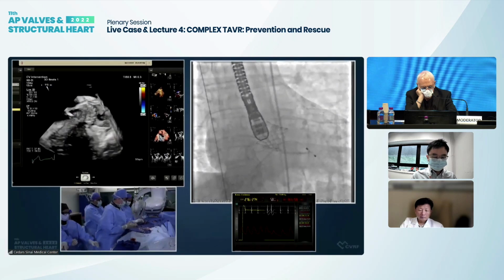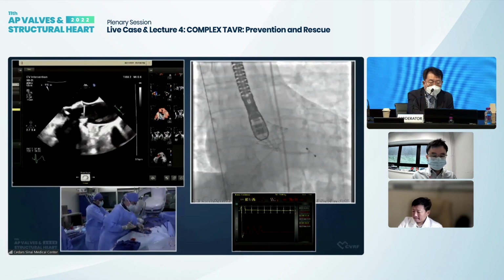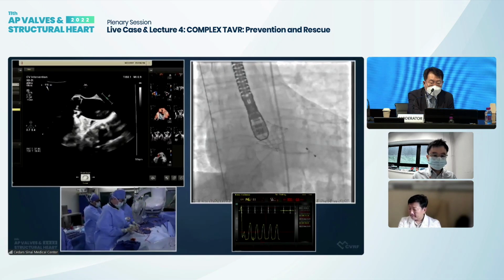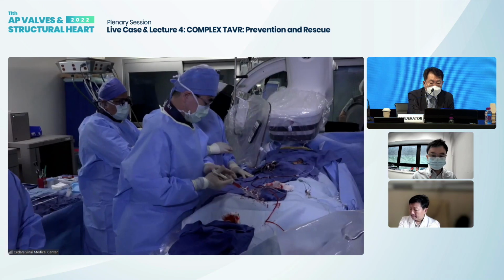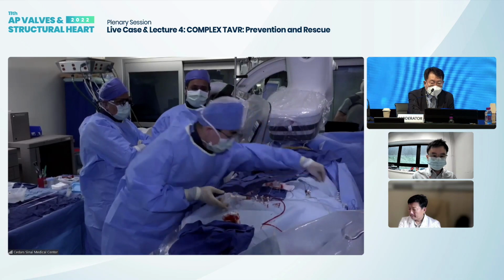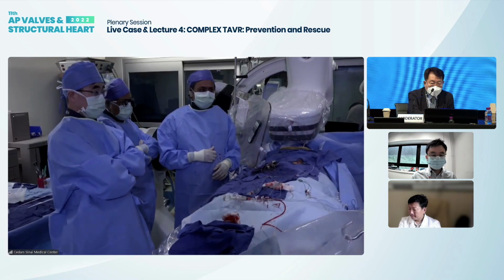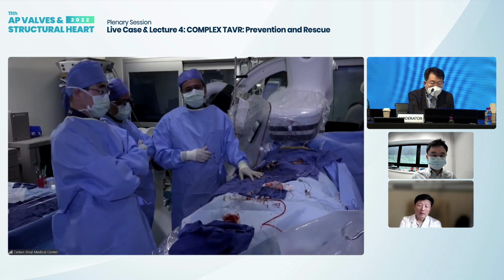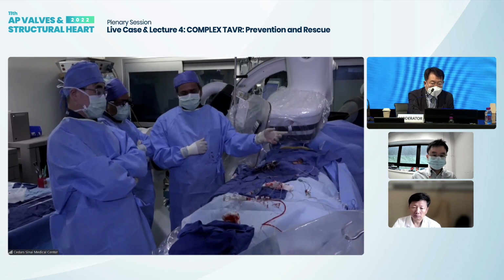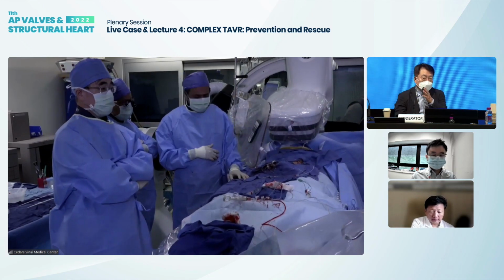Do you routinely use transesophageal monitoring during the procedure? So, I always say TEE is a luxury, and I think we were all spoiled in the early days of TAVR. And we then switched. There is a lot of pressure to not use general anesthesia, of course, and keep the procedure simple and improve the efficiency in the lab. So we have switched to conscious sedation and transthoracic echo. But when it comes to patients like this, I think it is best to do these patients with transesophageal imaging.